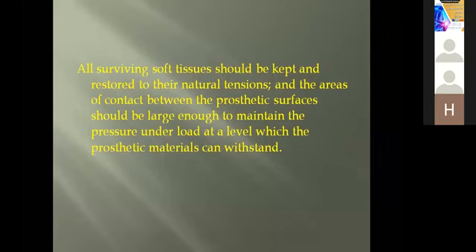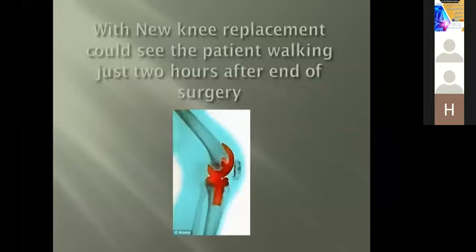All surviving soft tissues should be kept and restored to their natural tension, and the areas of contact between the prosthetic surfaces should be large enough to maintain the pressure under load at a level which the prosthetic material can withstand. With the new replacements and the new concept of one-day procedure, one-day hospital, swift total knee, the patient should be able to go walking just 2 hours after the end of the surgery.